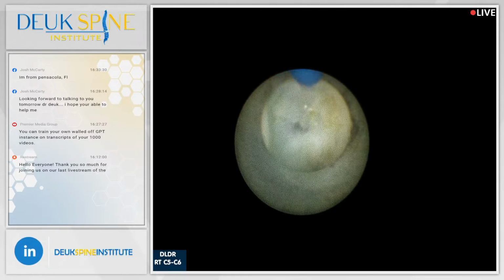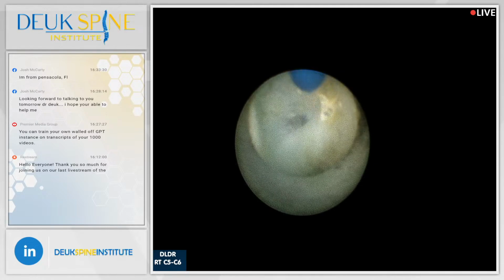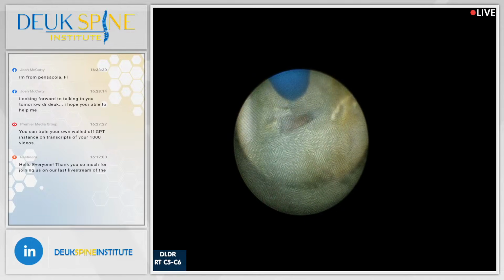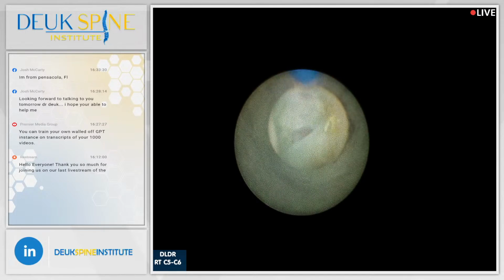That's a tear in the posterior ligament. There's a little bit of herniation there. We just have to be really careful. See the tear? Yes, we do. Yeah, that's the spinal cord down there. That right there is the spinal cord, just behind that. Beautiful, huh?